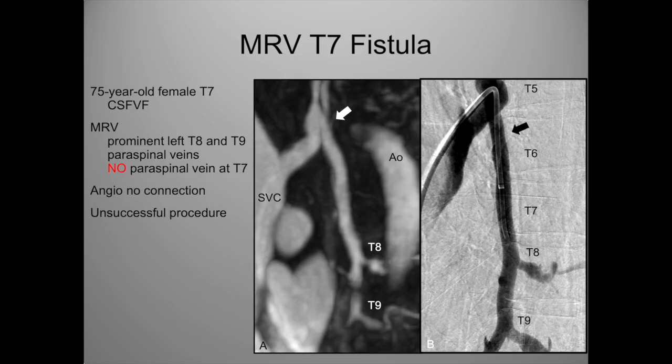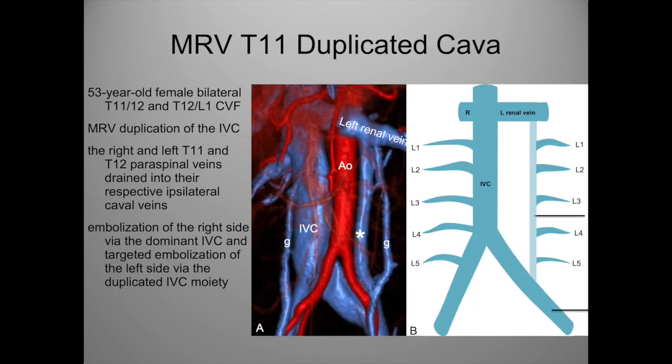We spent a lot of hours. We tried to get through the lower levels and go up the epidural, but in the thoracic spine it is not as easy as in the cervical spine to take that ladder up. So in the end, we couldn't do it, and we had to punt this to surgery. This is a relatively uncommon situation, but it did happen, and it does happen from time to time.